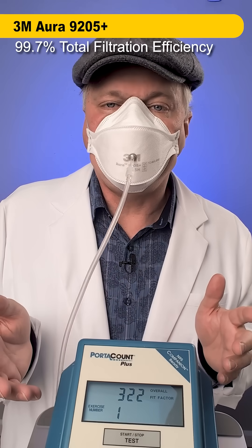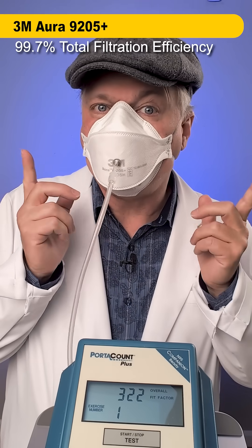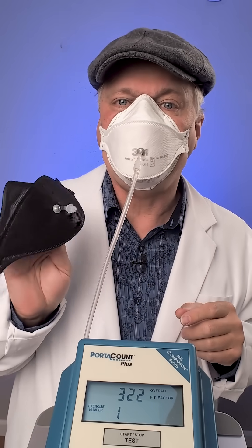We're also going to test this 3M Aura for comparison. It scores 322 — this mask turns out not to be as protective as the Tridents, but it is more comfortable and a lot less expensive.